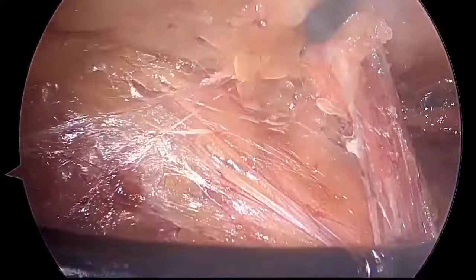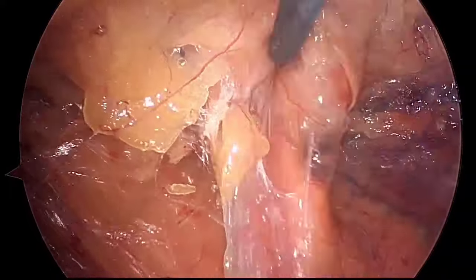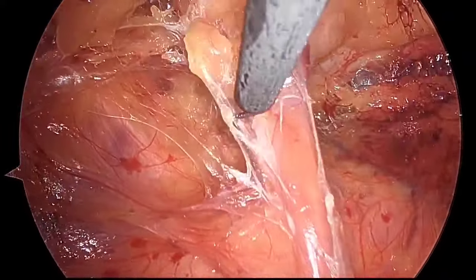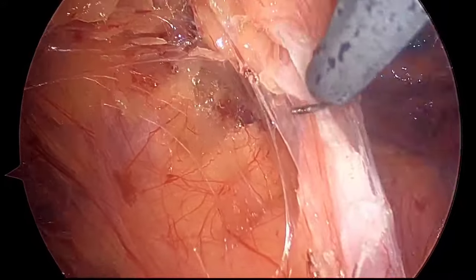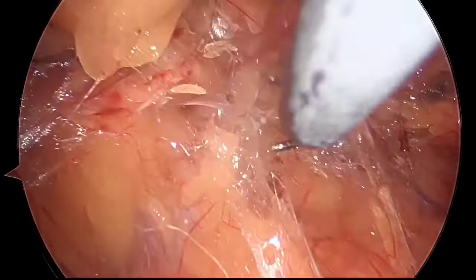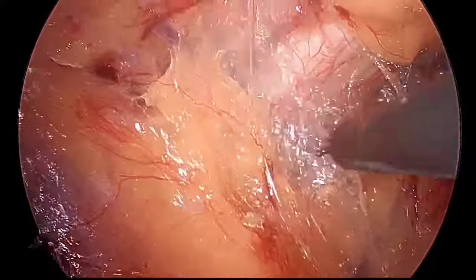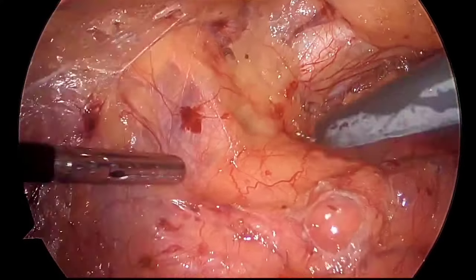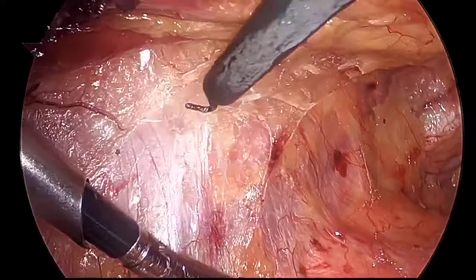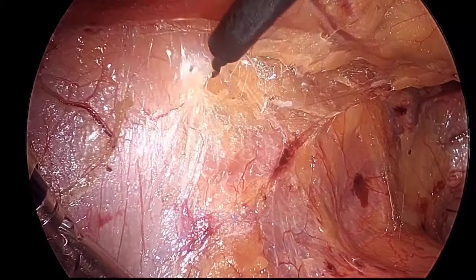So here there was a direct hernia, you can see. So this is a direct hernia, the preperitoneal fat which was going through the left sided direct defect. This is a pseudo sac I am getting reduced, and the further dissection will expose the Cooper's ligament on the left side also, and at least below the Cooper's line at least 2 to 3 centimeter we should dissect.